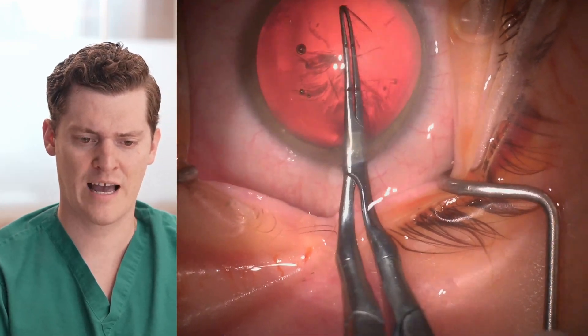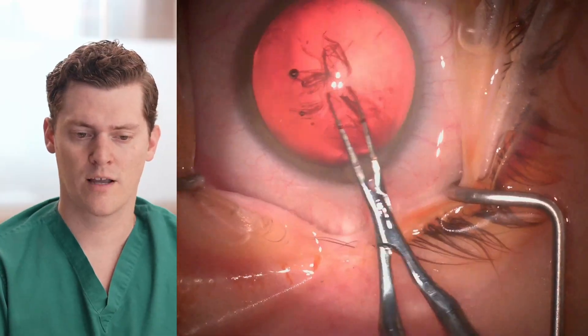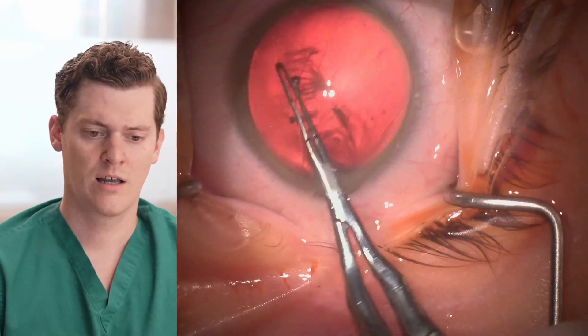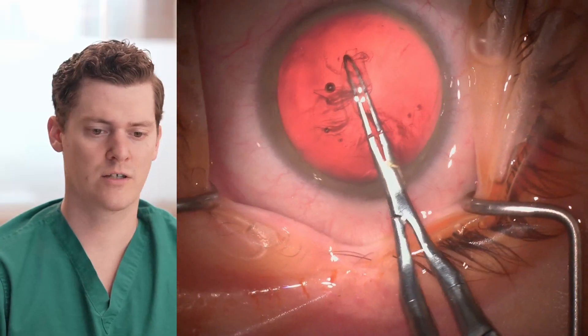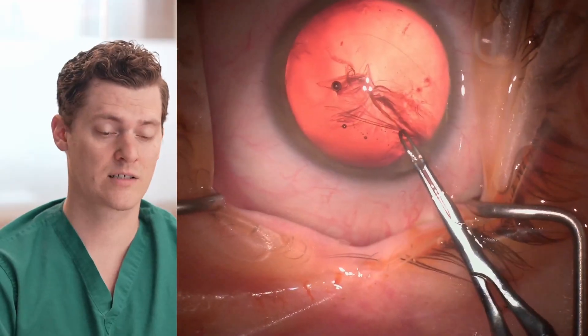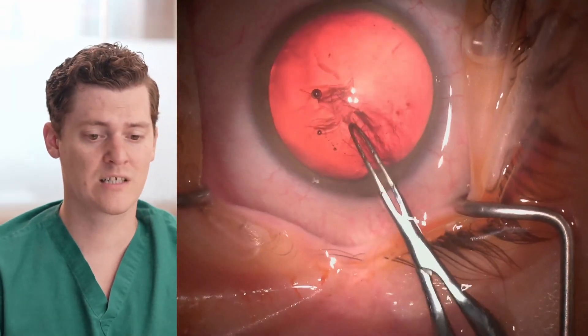At this point, I'm really starting to feel like I'm going to be able to save this capsulorhexis despite this pretty large run-out. Now that I have it more in a central area, I'm able to grab it normally and trace the area I want the capsulorhexis to run, being very gentle, and then complete the capsulorhexis successfully even though it had this pretty significant run-out.